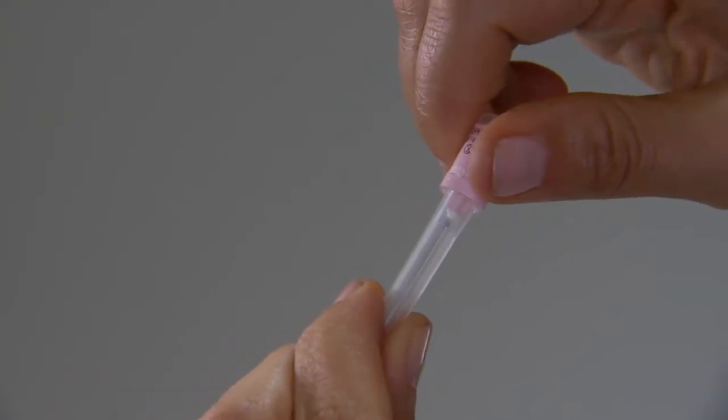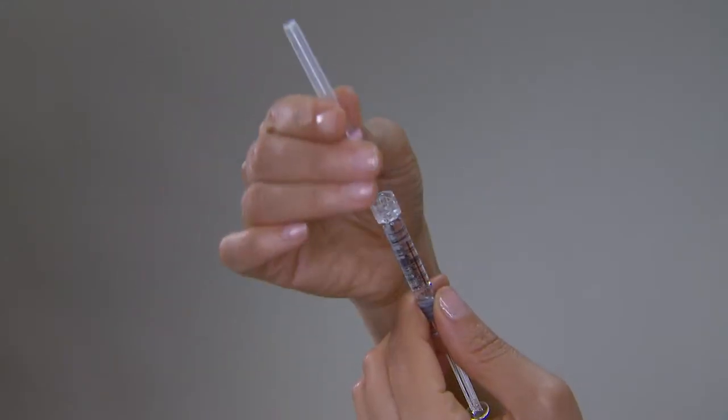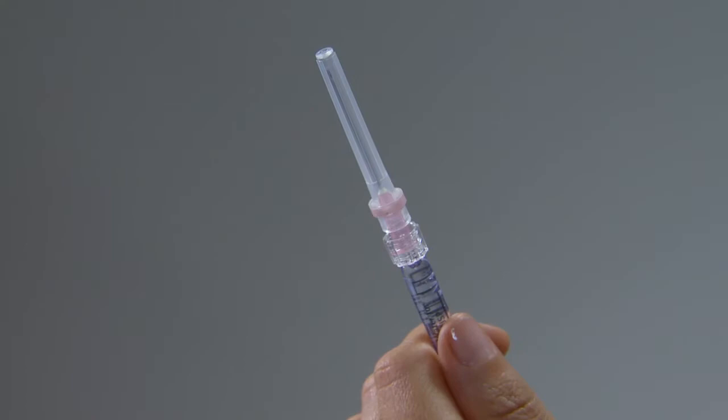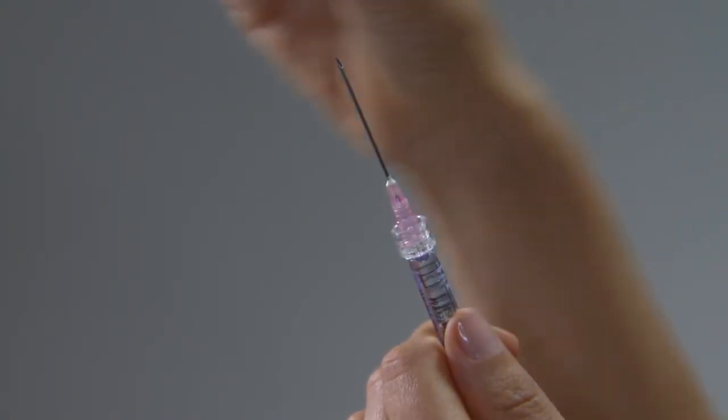Remove the safety seal cover of the 18 gauge 1.5 inch pink needle. Twist the mixing needle on the pre-filled syringe until it is tightened. Holding the barrel of the pre-filled syringe, carefully remove the needle cap.